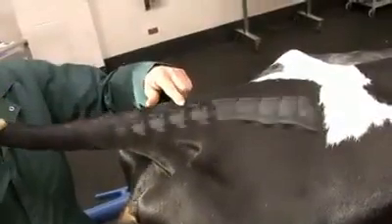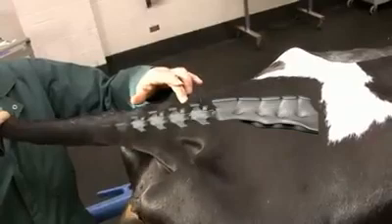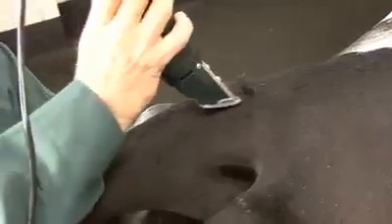This space is identified by gently lifting the tail up and down while simultaneously palpating for the first freely movable joint caudal to the sacrum. Once the proper site has been identified, the area should be clipped and surgically prepared. An 18-gauge 3.75 centimeter sterile needle is generally used to deliver the anesthetic, except in very large patients who may require longer needles. Locate the space with your finger.